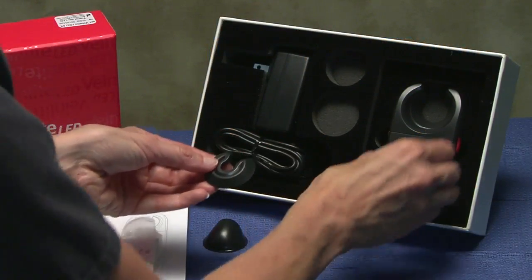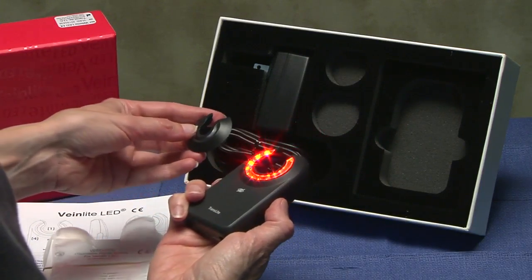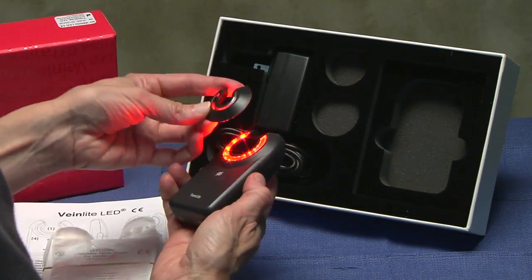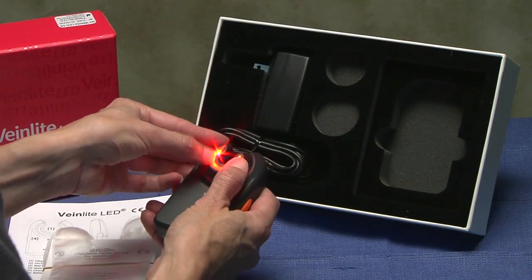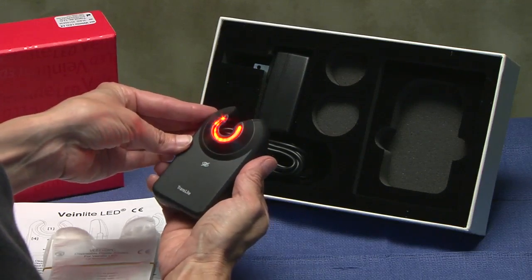To use the pediatric attachment, align the opening of the adapter with the opening of the device on the side where the LEDs illuminate. Place the wider side of the adapter over the clear window. Press down and you will feel it snap into place.